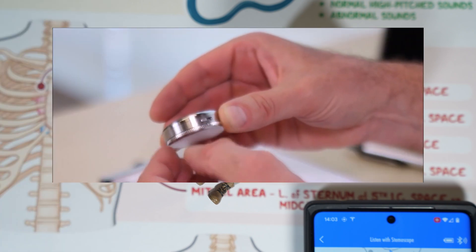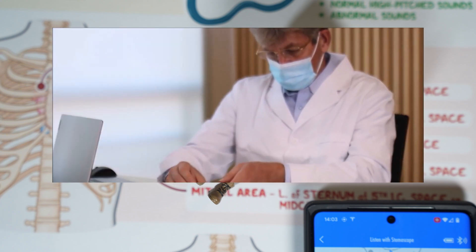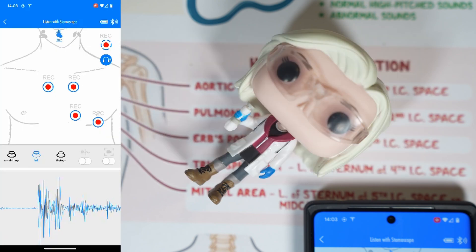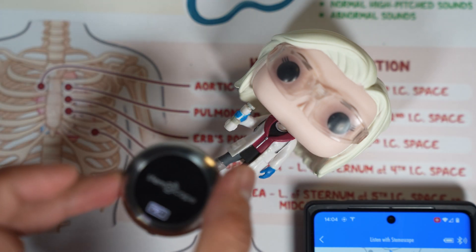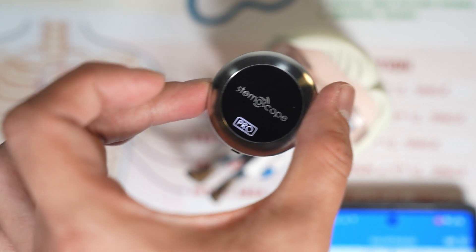You can also ditch the phone altogether and just use the Stemascope with Bluetooth headphones — it will connect automatically to unpaired phones. I have used it for a while and believe it is excellent for education. It does cost about $300, but you can use my affiliate code below for a 10% discount.